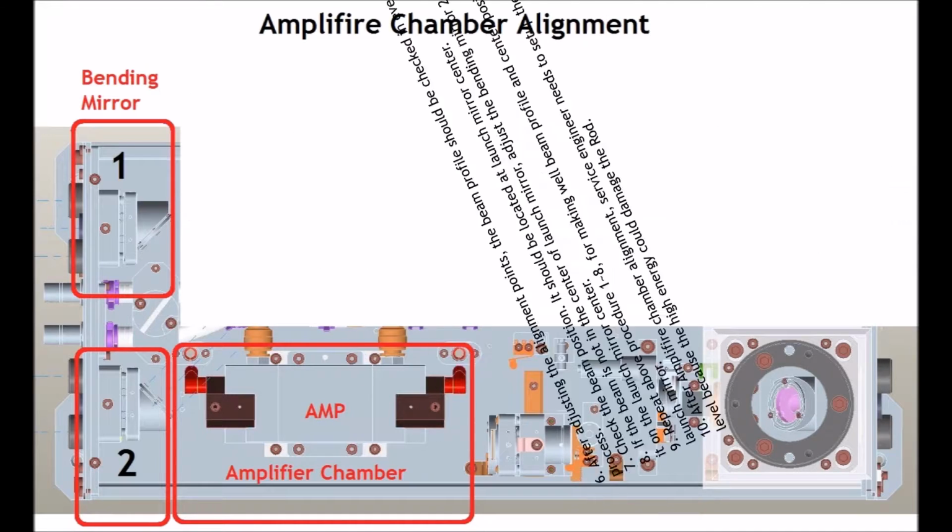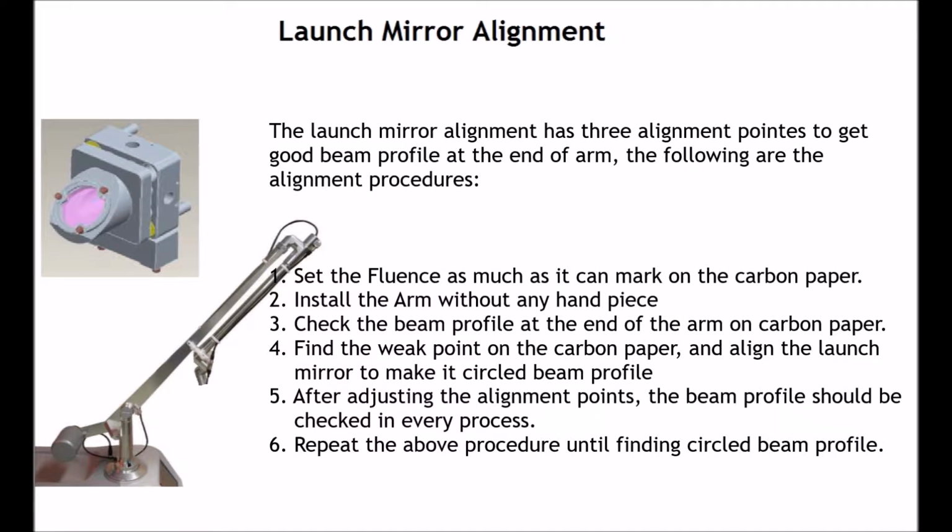The launch mirror alignment has 3 alignment points to get good beam profile at the end of the arm. Follow the following alignment procedures. 1. Set the fluence as much as it can mark on the carbon paper. 2. Install the arm without any handpiece. 3. Check the beam profile at the end of the arm on carbon paper.